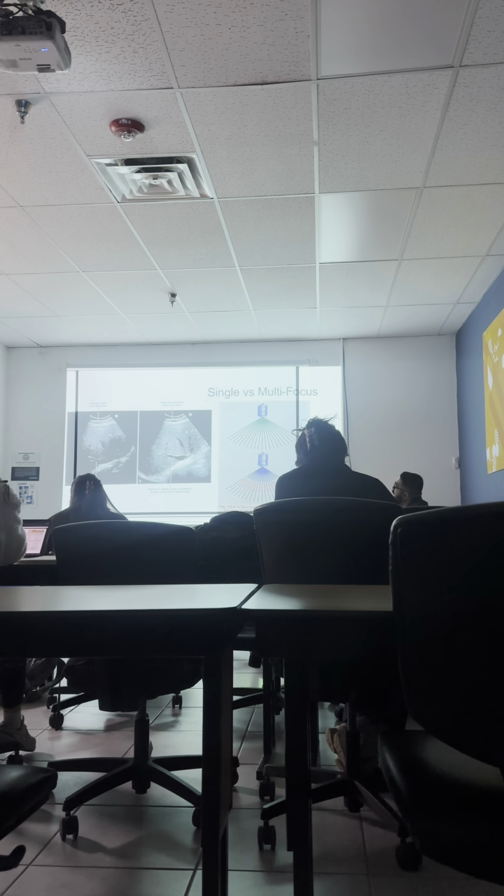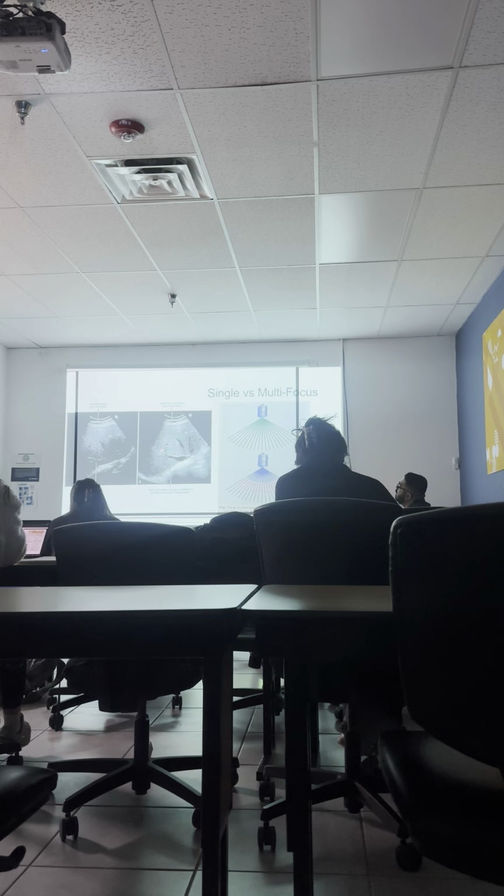Okay, so here we have a single focus versus multifocus. As you can see here, how many pulses do we have? We have 3 pulses per scan line, right? And then we have an array of 1, 2, 3, 4, 5, 6, 7, 8, 9, 10, 11, 12, 13, 14, 15, 16, 17, 18, 19, 20, 21.